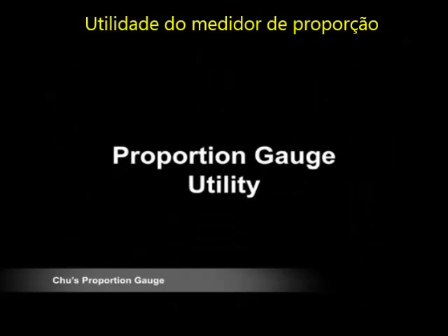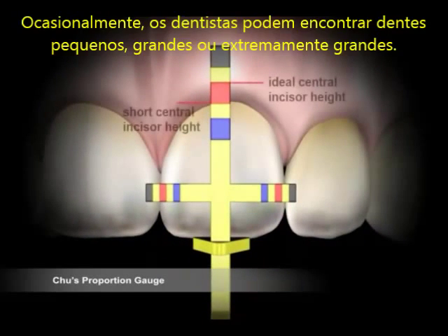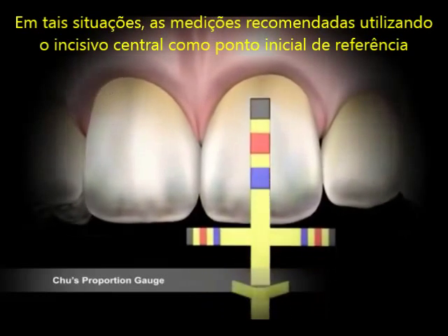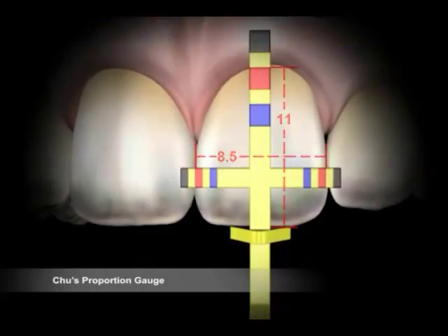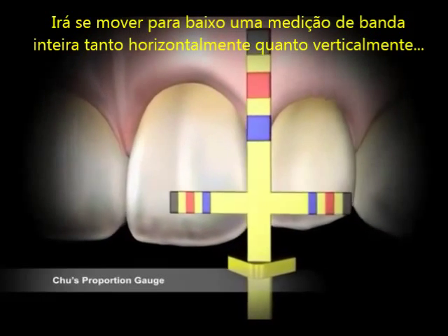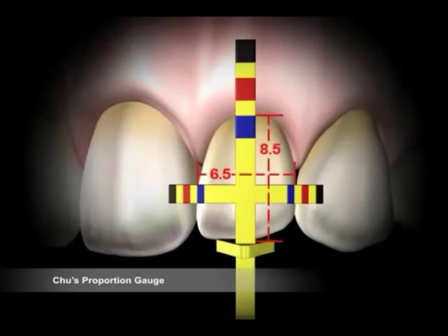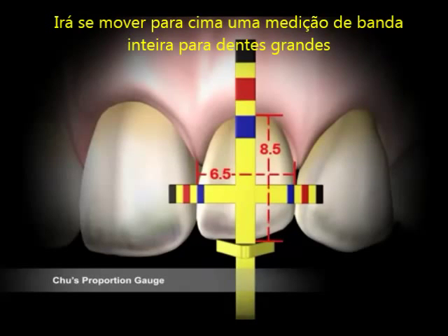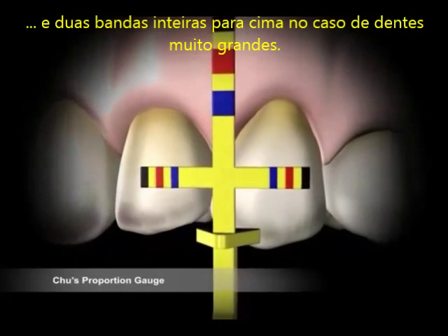Proportion gauge utility. Occasionally, clinicians may encounter small, large, and extra-large teeth. In such situations, the recommended measurements utilizing the central incisor as the starting reference point will move down one full band measurement both horizontally and vertically for small teeth, up one full band measurement for large teeth, and up two full band measurements for extra-large teeth.